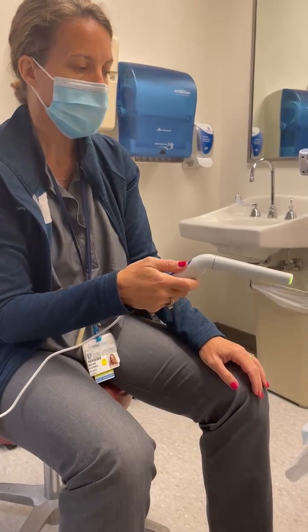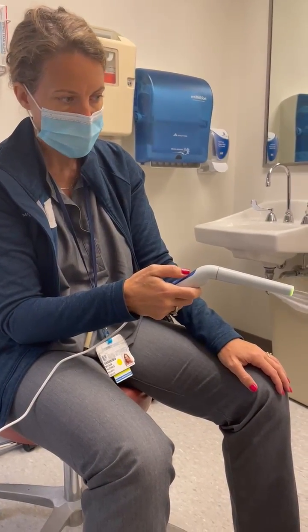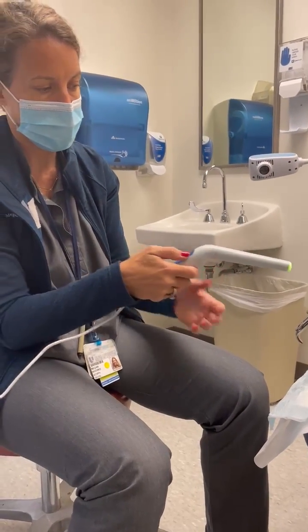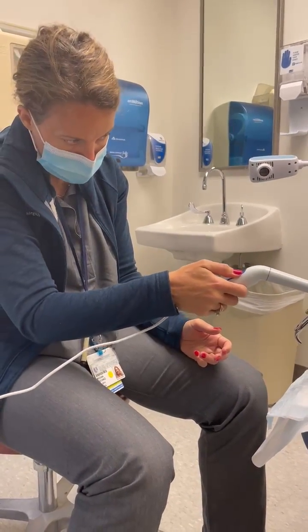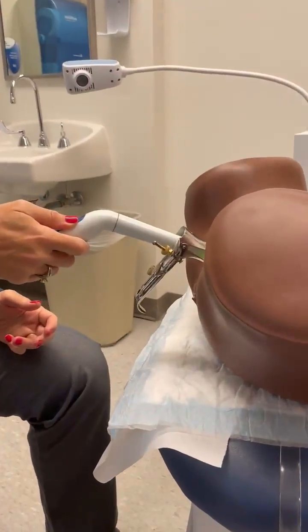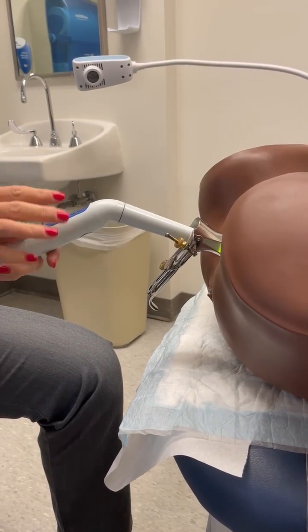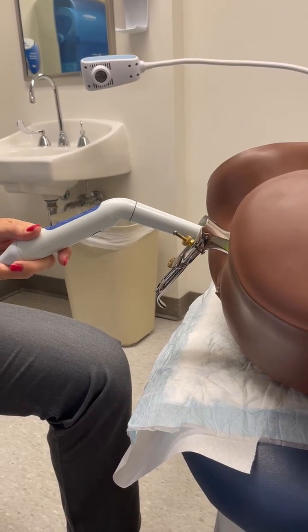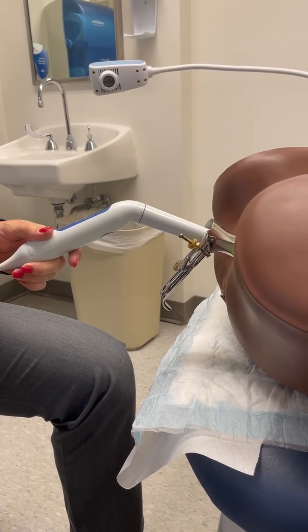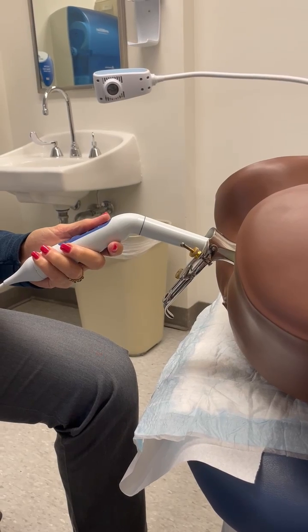I'd like to demonstrate the use of the pocket to do a colposcopically guided biopsy using our model. As you can see, the pocket sits in the speculum about one to two centimeters from the cervix. Usually you would have the pocket in place and the screen of the tablet or laptop next to you to get the image in sight.